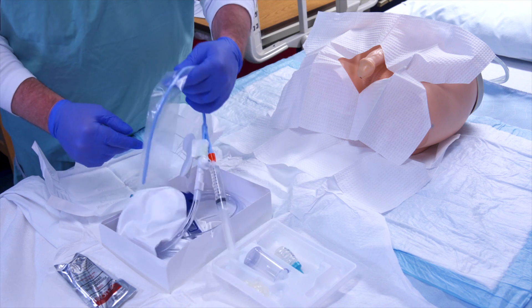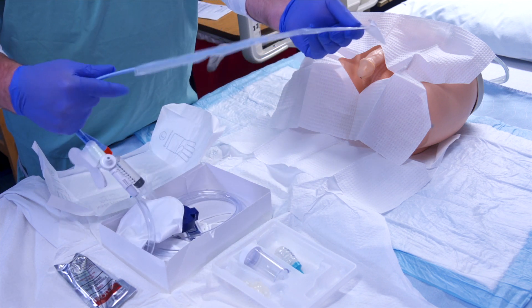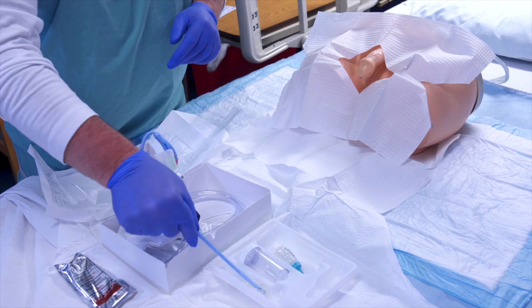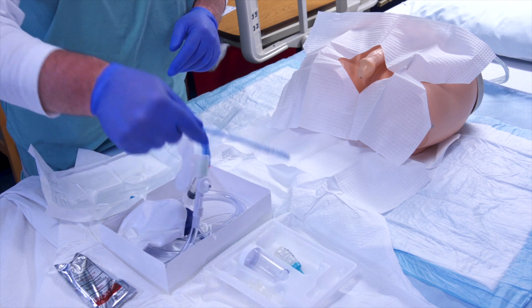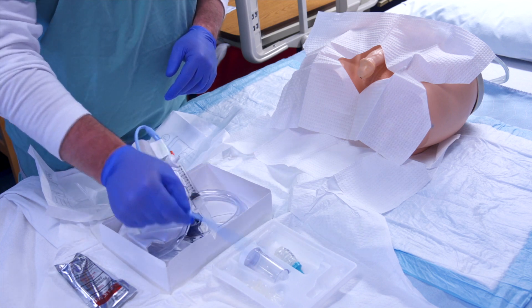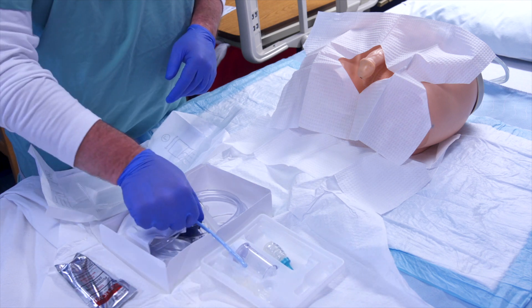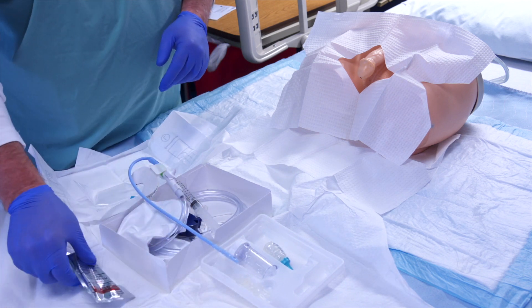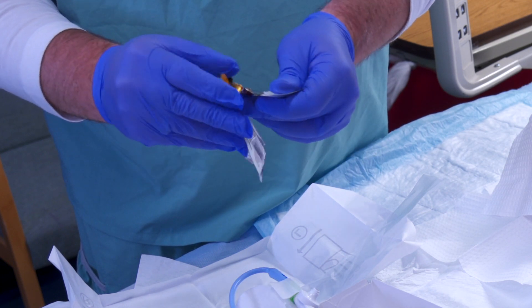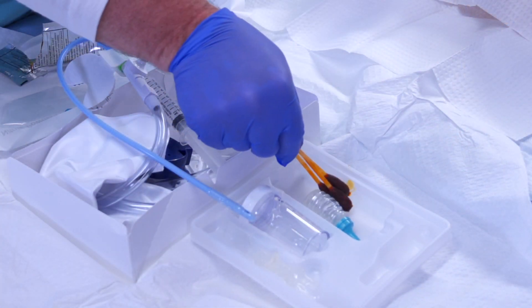With your sterile dominant hand, grasp the catheter and remove it from the tray. With your non-dominant hand, remove the dust cover off the catheter, making sure to keep the catheter over the sterile field. You may wish to coil the catheter for better control. Place the catheter tip into the lubrication jelly and roll the catheter to coat approximately three inches of the catheter tip, keeping the catheter tip and lubricant in the tray. Prepare the insertion site in a sterile fashion by opening the PVP solution packet, removing all three swab sticks, and placing them in the prep tray.